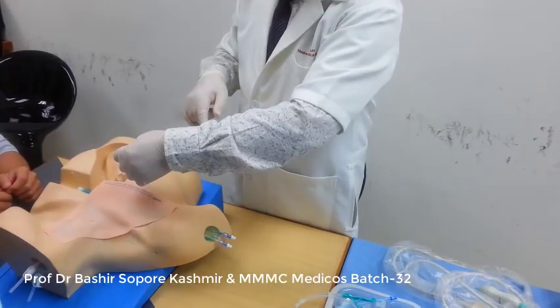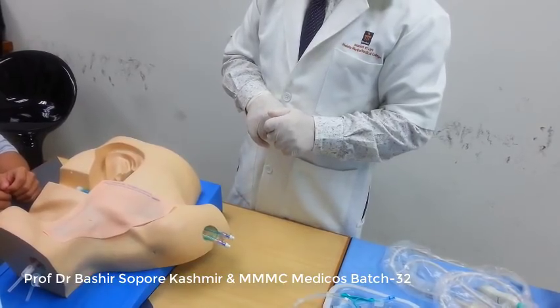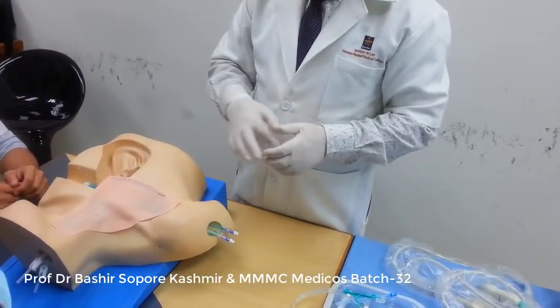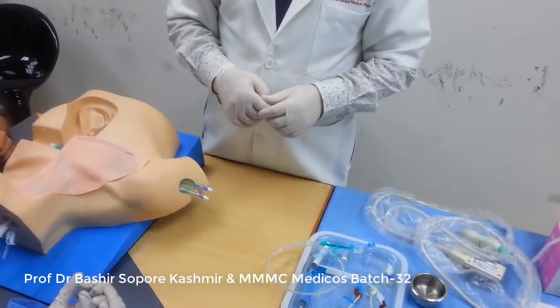Then we remove the guide wire and the dilator and keep the sheath introducer in the jugular vein. That is how we do it when we have to insert the pulmonary artery catheter. Now you can pause it again.